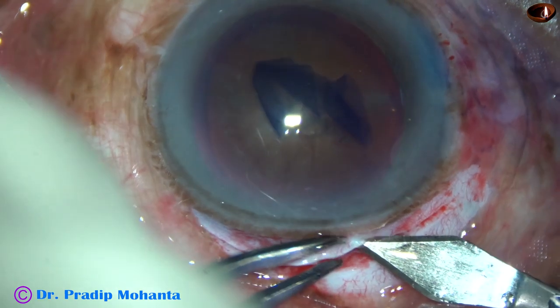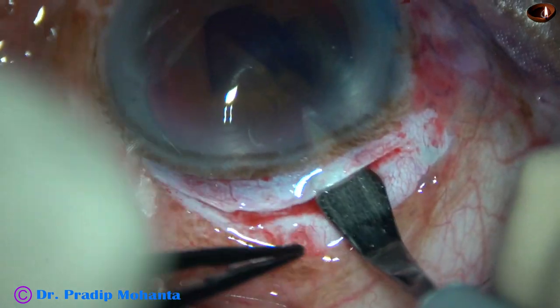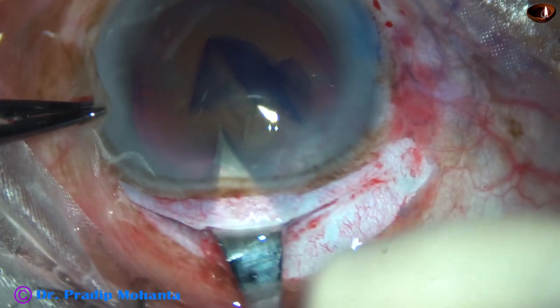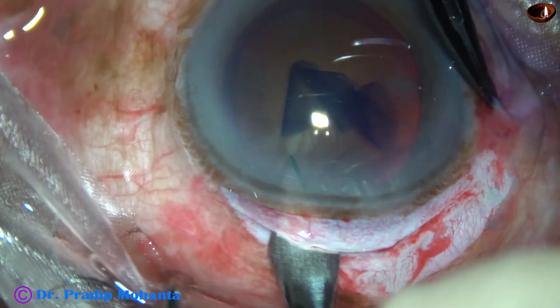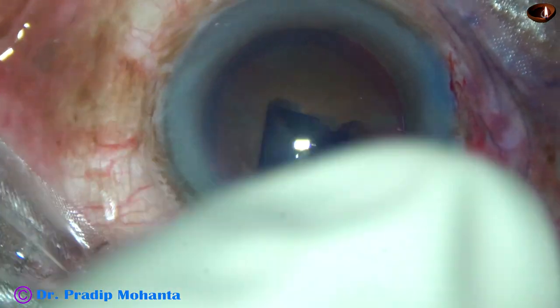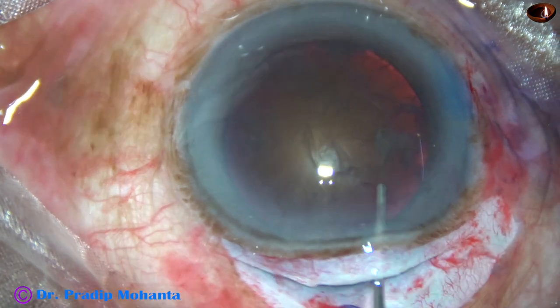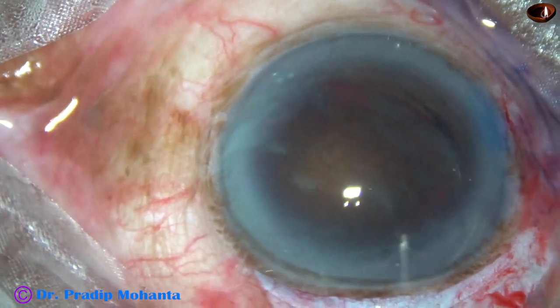Now I am going to open the main wound, the sclerocorneal tunnel. We must cut when we go forward, towards the anterior chamber. If we cut when we go anteriorly, the corneoscleral valve remains good and the wound becomes self-sealing. This is a large wound and I am not going to depend on self-sealing. The construction of the wound is neither a straight incision nor a frown incision, so I have already decided to put sutures.